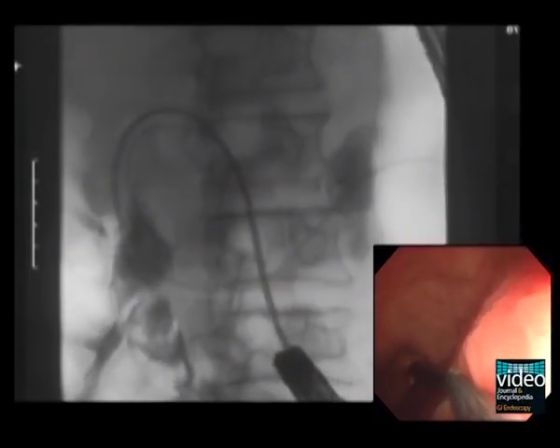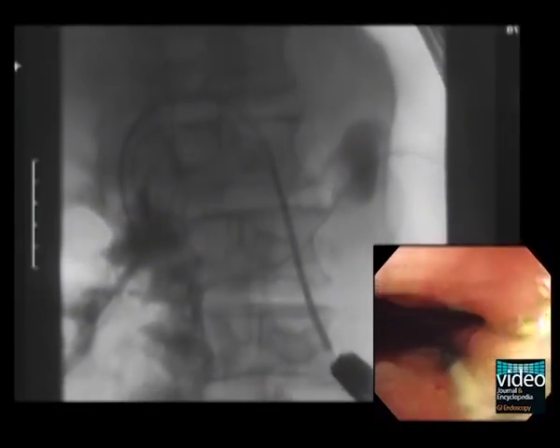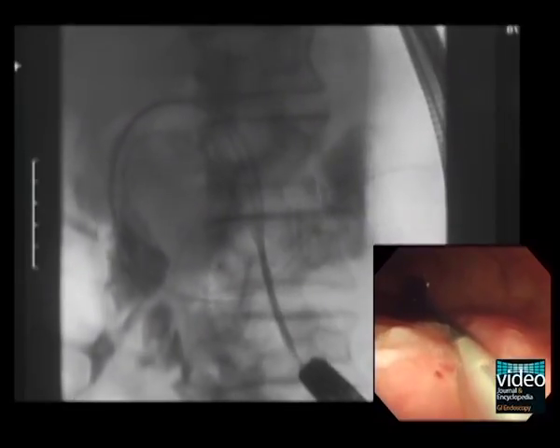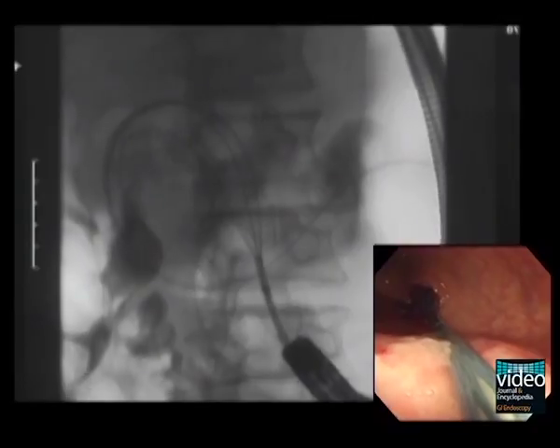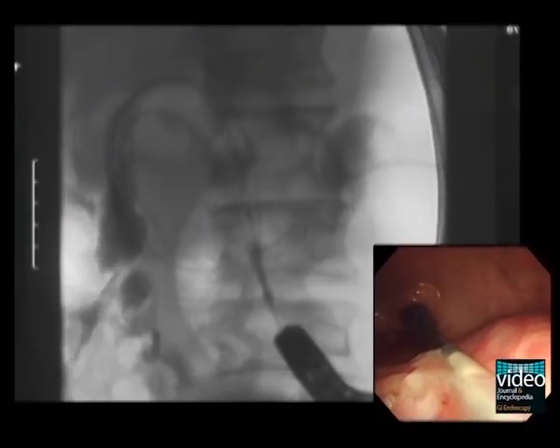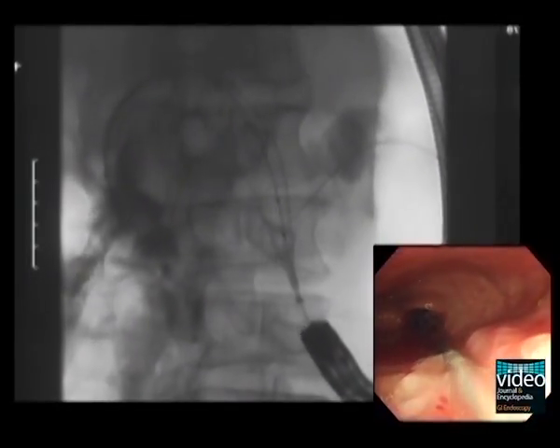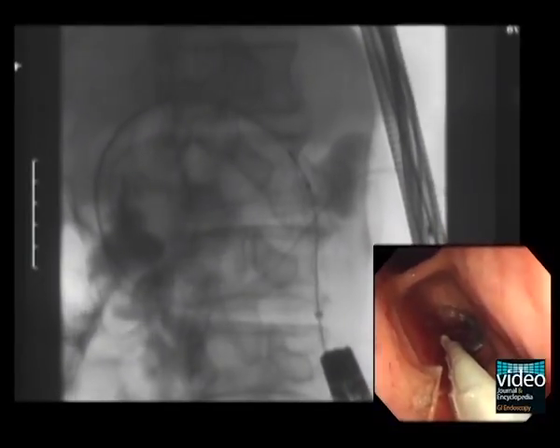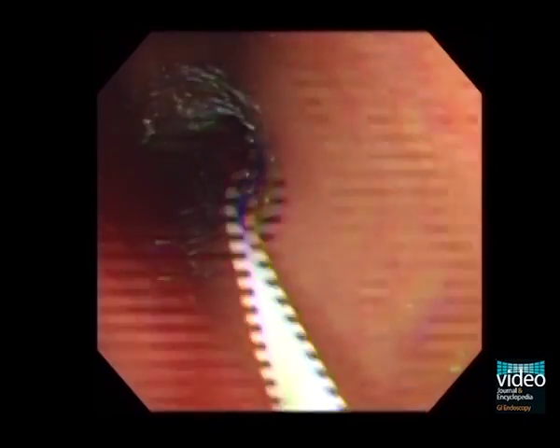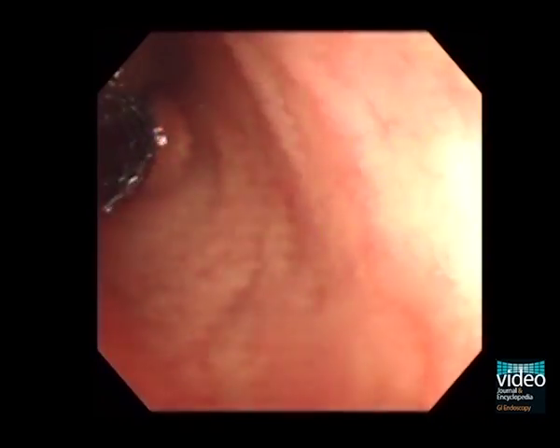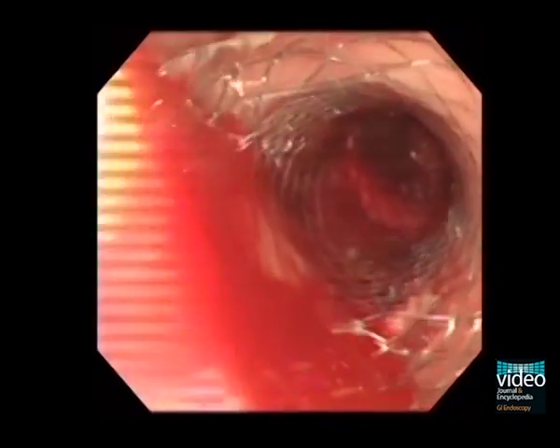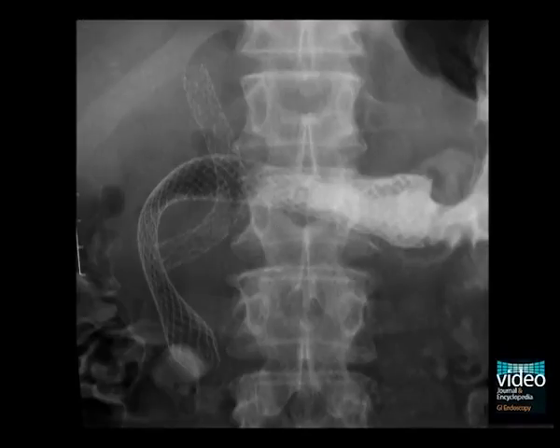The outer sheath is gradually pulled to deploy the stent. The stent has been deployed and was successfully placed at the optimal position. This X-ray photo, taken shortly after stent placement, shows that the stent has been flexed at the superior duodenal angle.